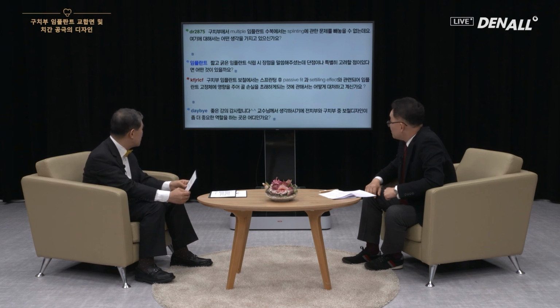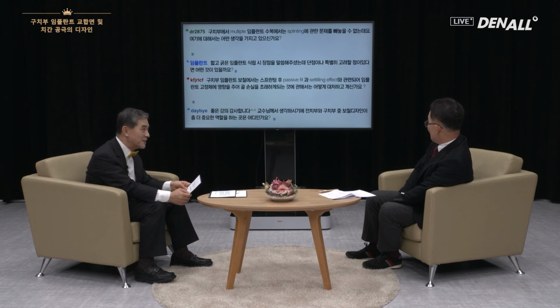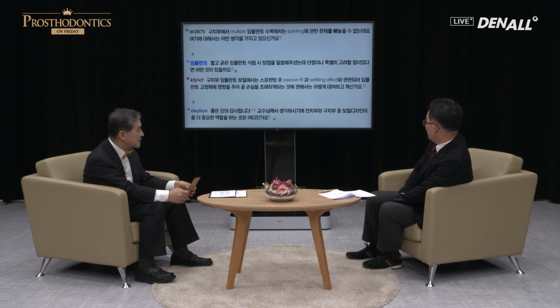Last question by Day-by. Can we cover the question? Yes. Between anterior and posterior region, which part is more important when it comes to the prosthetic design? It is a difficult question. Anterior region is important for aesthetics, and the posterior region, we need to design properly the appearance also for function. I believe both of them are important in the design.